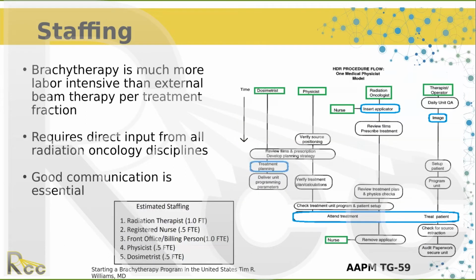So the staffing: it's much more labor intensive than external beam. There's a lot of teamwork involved, and there are a lot of players. It requires the engagement of all these different individuals and team members, so good communication is essential. It's essential in all things, but even more so with HDR. HDR has a high potential for a severe complication if it's done improperly.